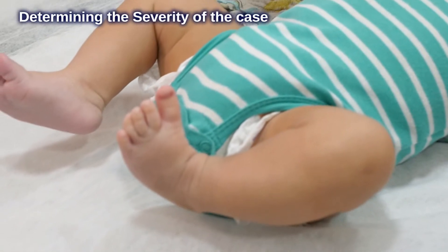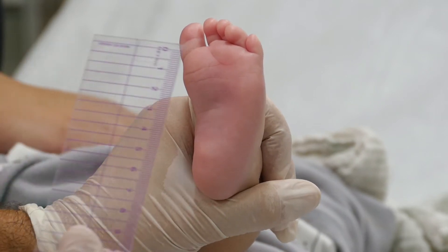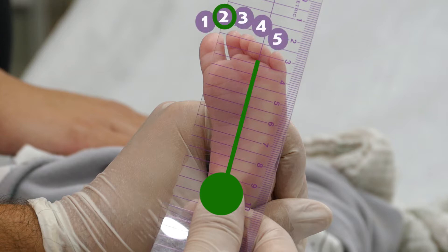Three types of parameters are considered to determine the severity of the case. The first is the heel bisector classification, performed using a ruler according to Bleck's method. Place the ruler in the middle of the heel and check the heel bisector line — it should properly point towards the second toe. If it points towards the third toe, severity is low; towards the fourth toe, moderate severity; towards the fifth toe, high severity. In our case, the ruler points between the fourth and fifth toes, so the result is moderate to high severity.